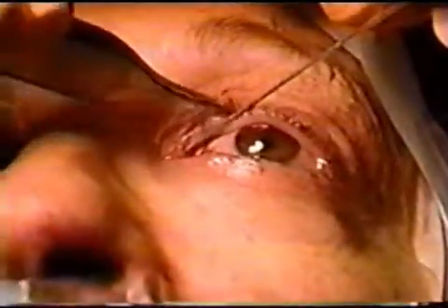The sheath with the enclosed long probe is inserted through the superior punctum and canaliculus and pushed through the DCR or balloon DCR ostium into the nose.